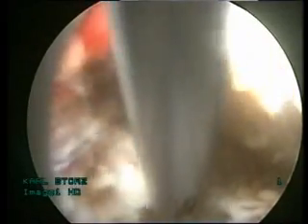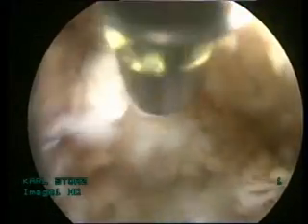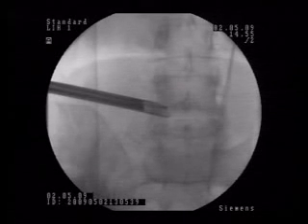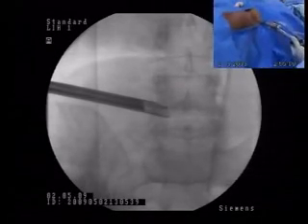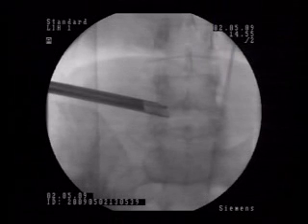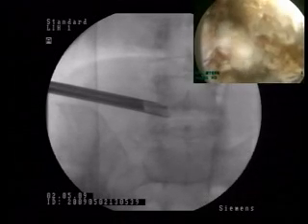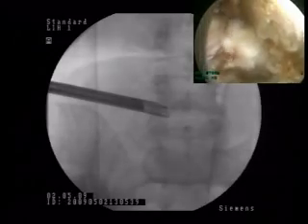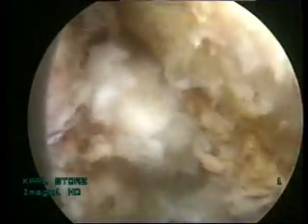Our aim is to remove the total fragment. Since the fragment cannot always be removed in one piece, it is removed piecemeal by proper positioning of the instruments. The instruments are positioned in the axilla, as seen in the AP picture on the C-arm, and the grasper is placed in the axilla.